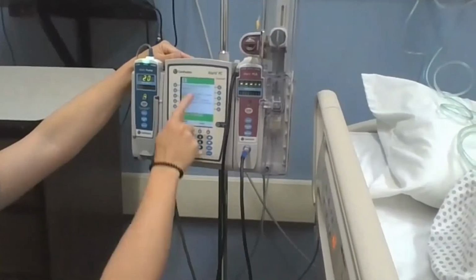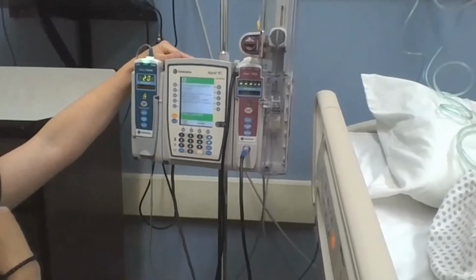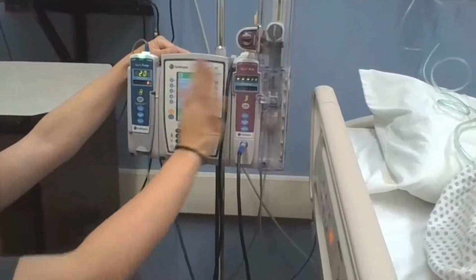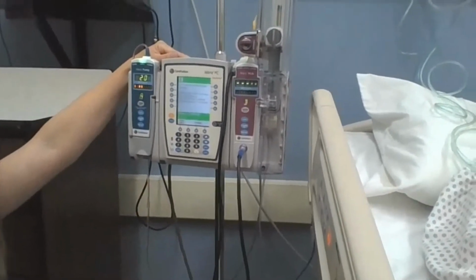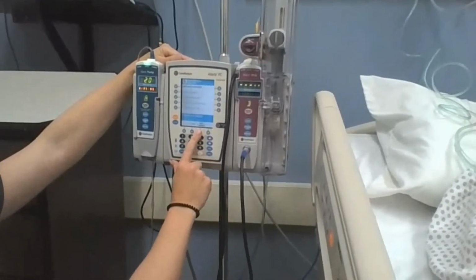and I'm going to confirm that. And it's having me review the PCA pause limits. This is basically saying if I have a respiratory rate of 8, this is going to stop and freeze out my PCA so that the patient can't get a button. And so those are the pause limits on here. It's just safety that are built in. So I'm going to confirm it.